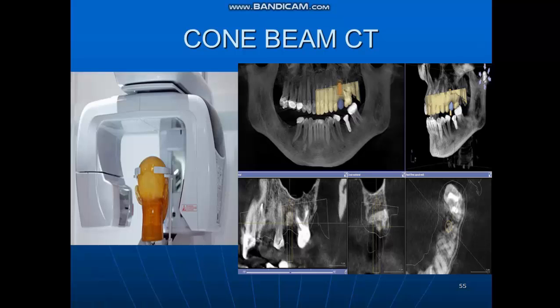And an important method in the maxillofacial region is cone beam CT. Cone beam CT is a variation of the traditional computer tomography system. These systems used by dental professionals rotate around the patient, capturing data using a cone-shaped X-ray beam.